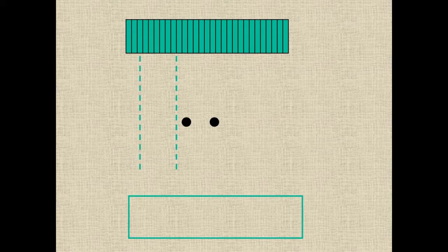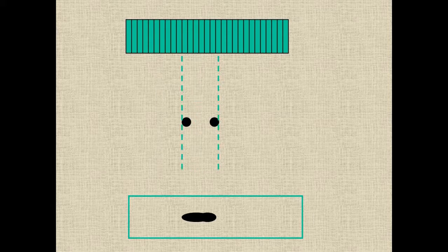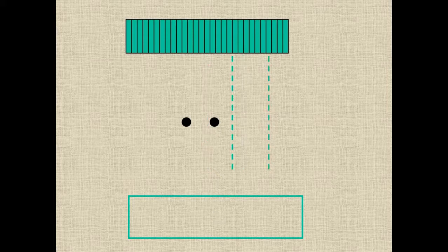If we look at these series of diagrams, we can see a relatively broad beam width scanning across two reflectors, and if you look at the bottom of the screen, you can see the effect of this on the finished article on the ultrasound screen. So as the beam moves across, there'll be a point where it is interacting with the first reflector, then it's interacting with both reflectors, then the last reflector, and finally it's moved away.